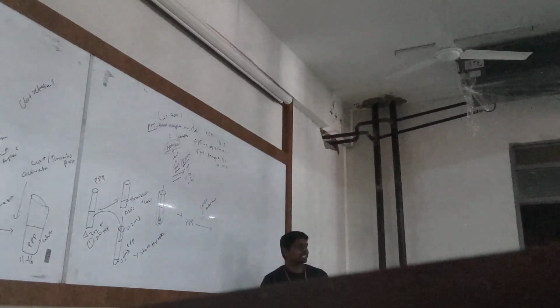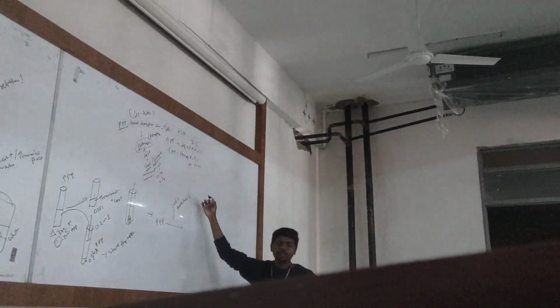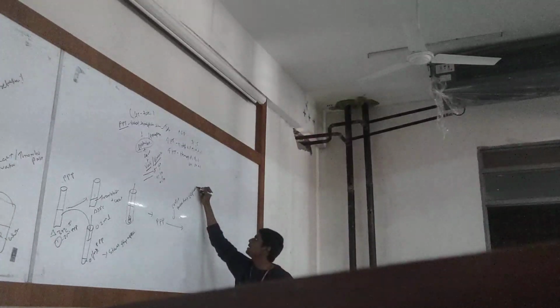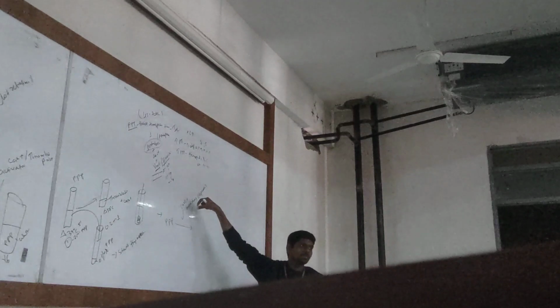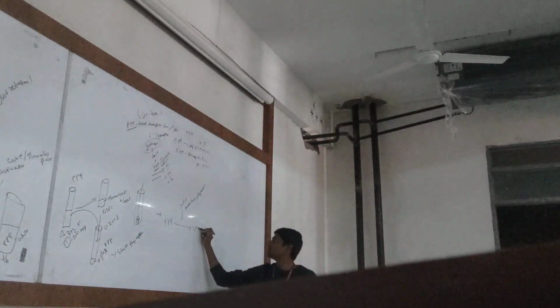This partial thromboplastin reagent is called cephalin commercially. Partial thromboplastin is available as a medicine called cephalin. So we will add cephalin. Cephalin is from partial thromboplastin, that will activate and it will clot.